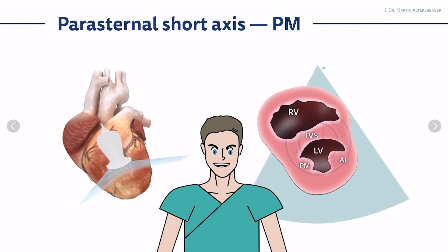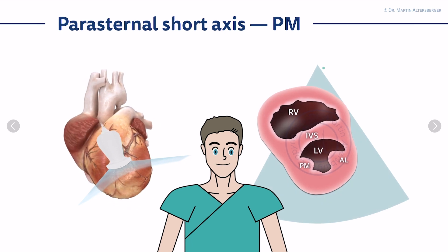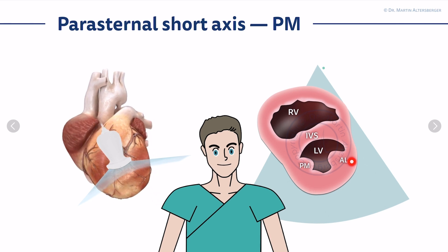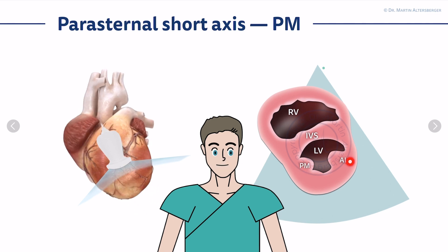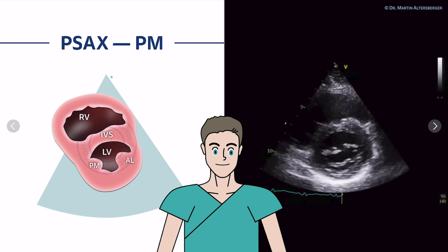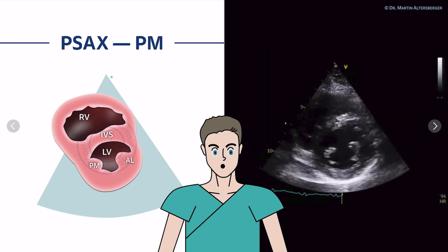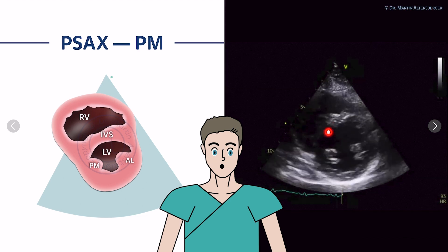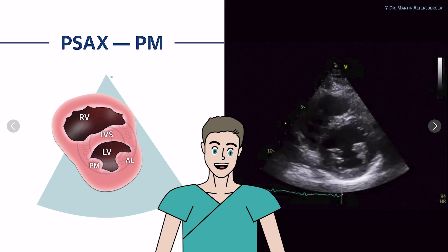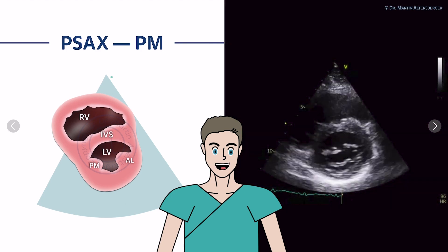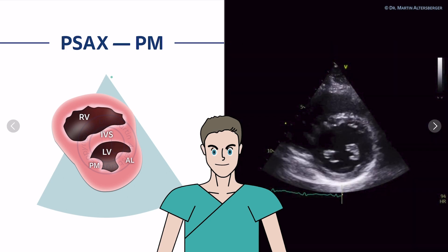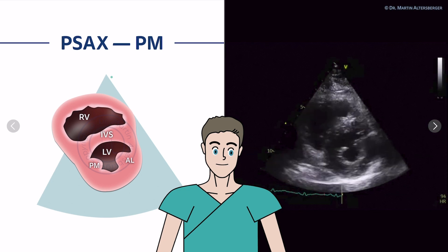The next view to discuss is the papillary muscle view. By tilting from the aortic valve to the mitral valve and toward the apex, we arrive at another view of the left ventricle showing the posterior medial and the anterior lateral papillary muscle. We see the cavity of the left ventricle — first parts of the mitral valve, then the level of the papillary muscles with a nice round left ventricle and normal left ventricular function. Also focus on the pericardium; sometimes you can see pericardial effusion.